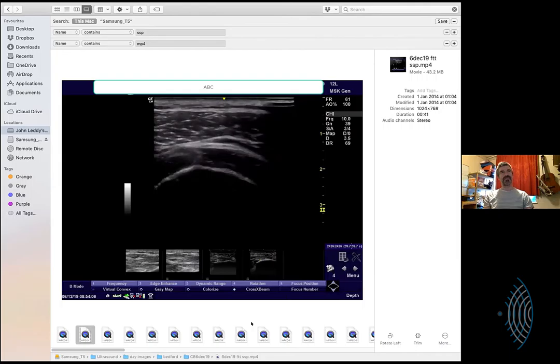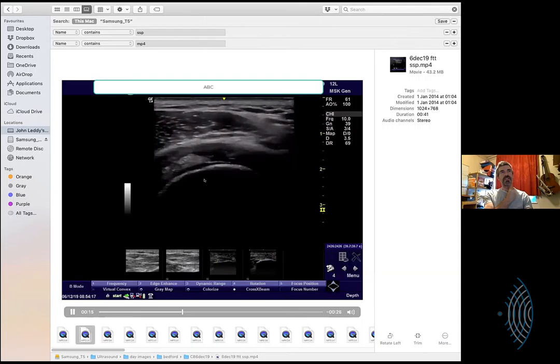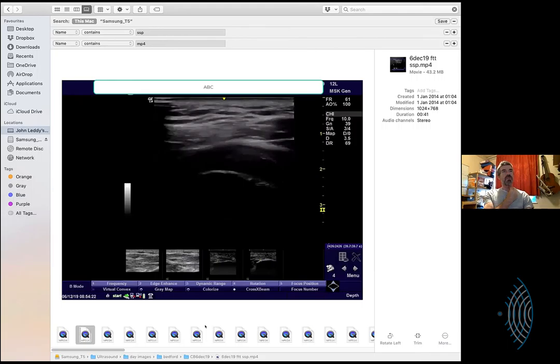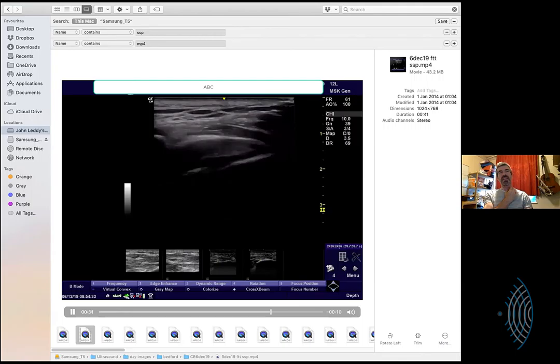You see it nicely. When you say boring bits, John, I'm actually watching you manage the probe, and I'm looking at you refining the 1 pixel thick bone. Yeah. You remember? Sometimes I'm doing it better than others, but that's fine. But you see, you're going down through an area of tear, so the bone is going to be different. But when I'm right, the bone is very thin, except in this area.